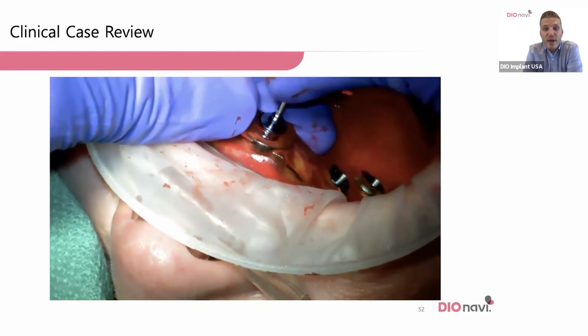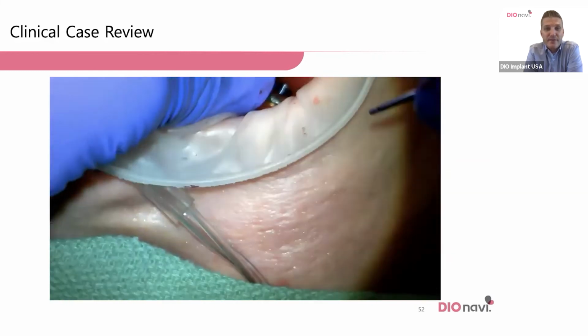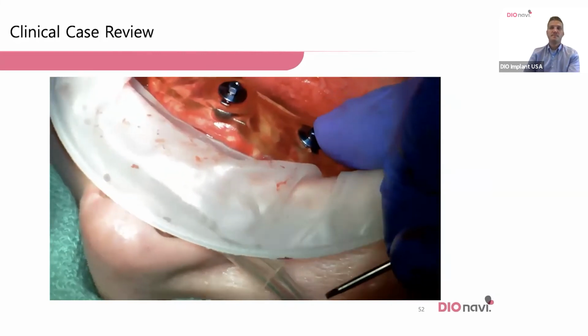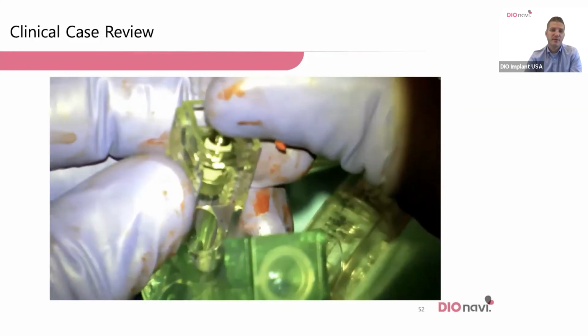Okay, so done bone packing. Now I'm putting the surgical guide back on. I want the guide accuracy for the implant. So I'm going to load up the dental implant here in just a second, and then we're going to put that dental implant in. So there's our dental implant, loaded up.